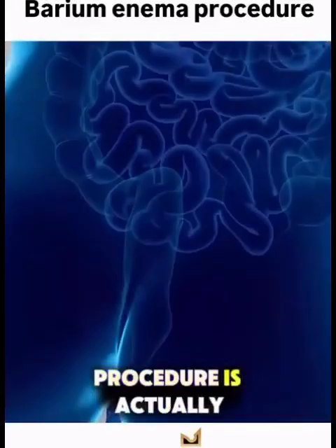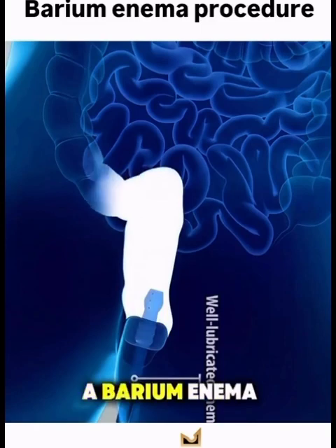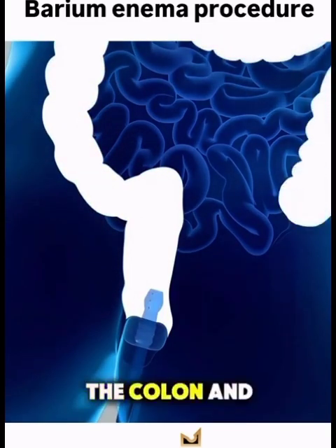Ever wonder how a barium enema procedure is actually done? Let's break it down in under a minute. A barium enema is a special x-ray test used to look at your large intestine, the colon, and rectum.